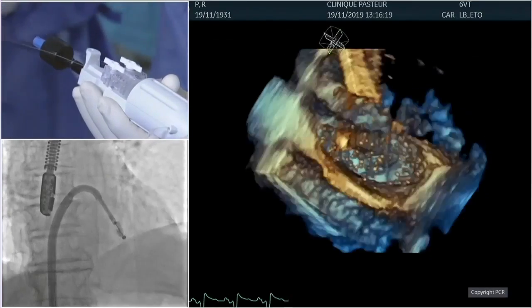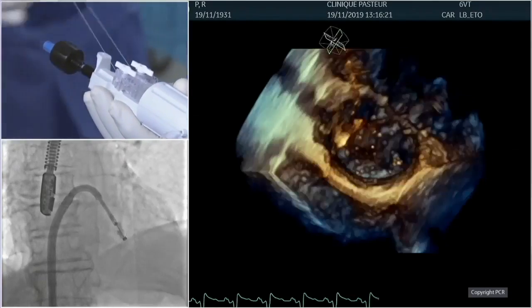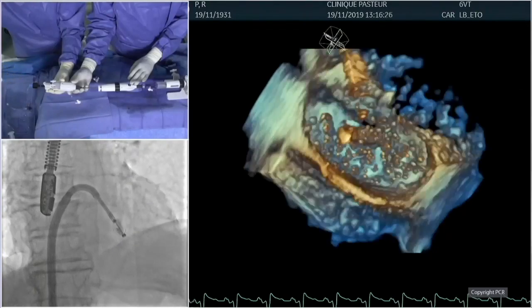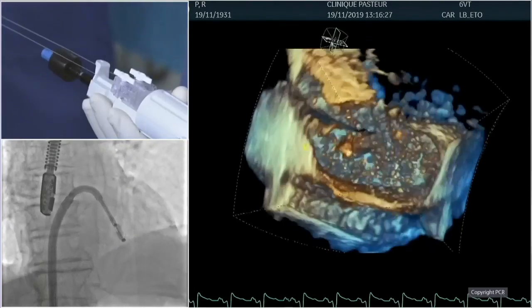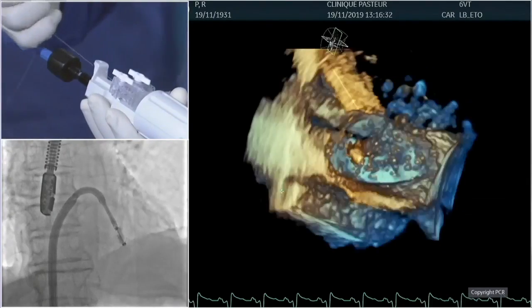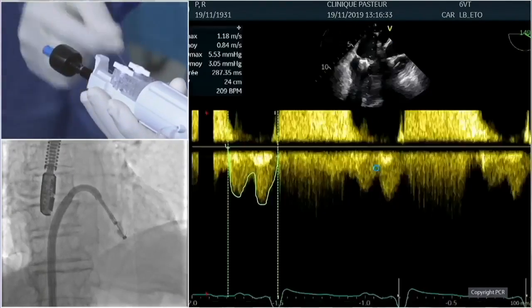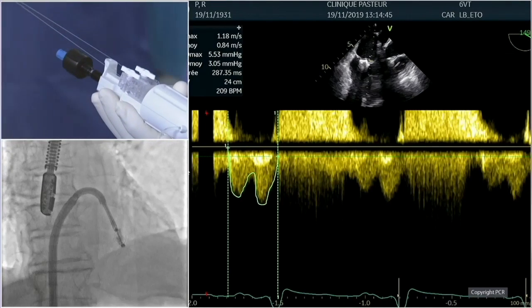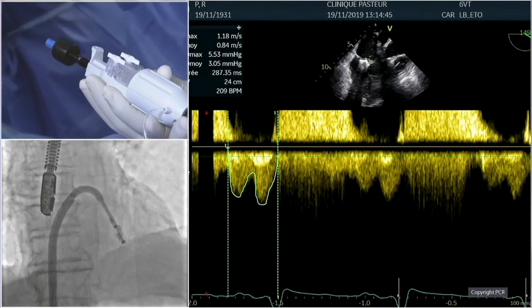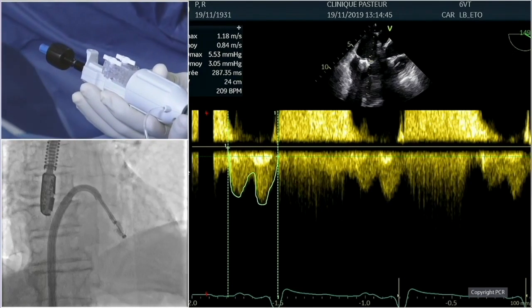the second device. So, Philippe, what we want to get rid of the mitral regurgitation, but not to create a mitral stenosis. So we measure the mean gradient. It was 3 millimeters of mercury now on assessment. What is the threshold? How much can we accept? As a final result, I'd really like to see the gradient not to be more than 5 millimeters of mercury, but I totally have to agree with everything which has been said.